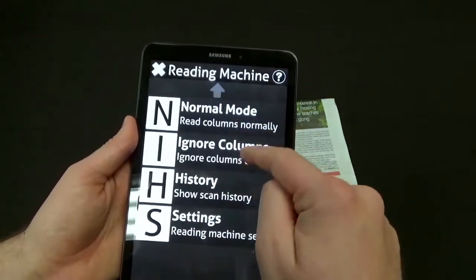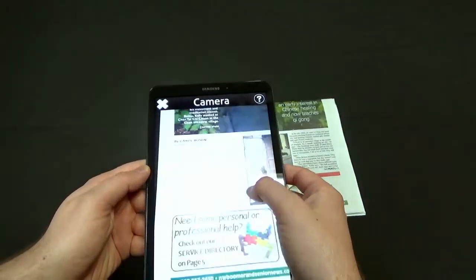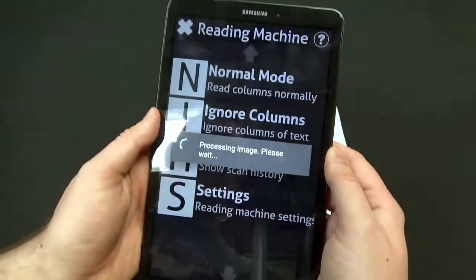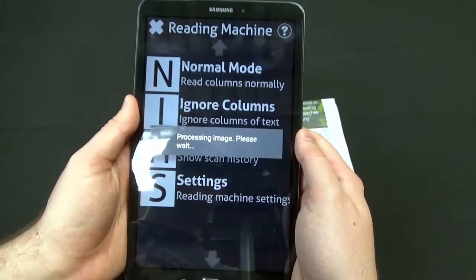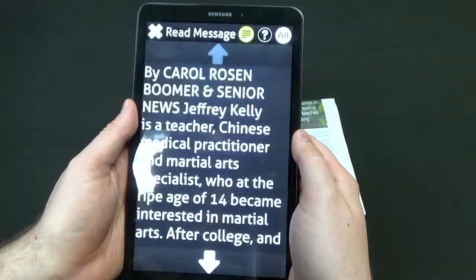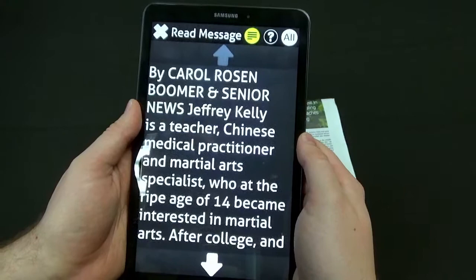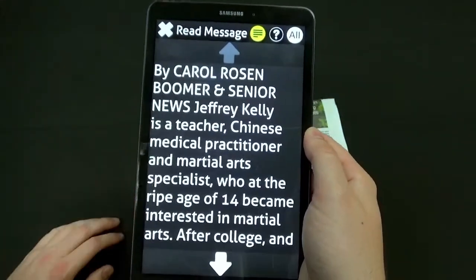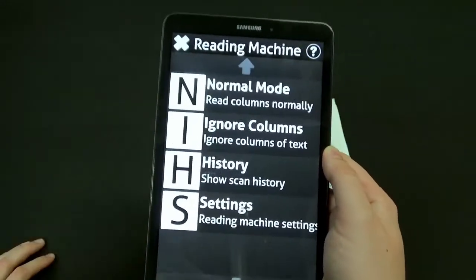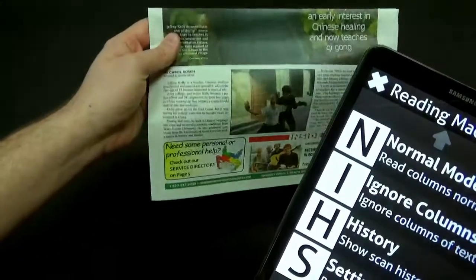Let's back out and try OCR and reading. We'll do normal mode — there's also a column-specific mode. Processing the image... 'Multiple pages by Carol Rosenboomer and Senior News. Jeffrey Kelly is a teacher, Chinese medical practitioner and martial arts specialist who at the ripe age of 14 became interested.' As you can see, it was really quick and really accurate too — it did a really nice job of OCR on this little newspaper clip.